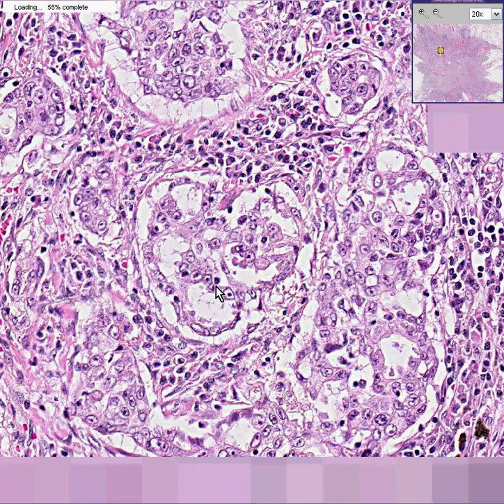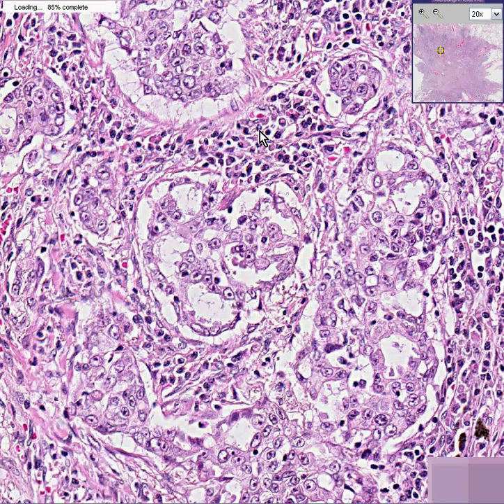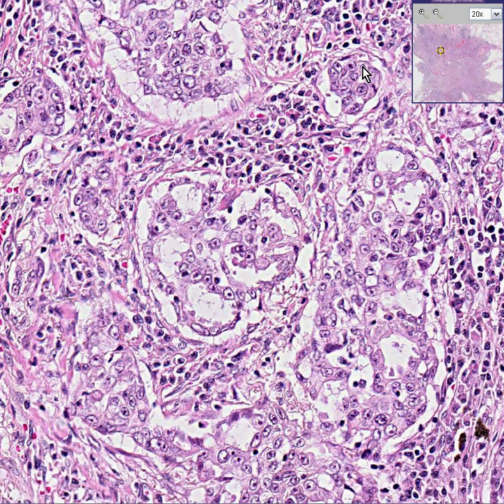In fact, I would like to think that the nucleoli of many of these tumor cells appears to be about the same size as the full nuclei of the lymphocytes. Here's a little tumor cluster here, same thing. Here's a little tumor cluster here, same thing. But once you see these little abortive tumor nests in which they are abortively trying to form a lumen, and some of them do, you know this is an adenocarcinoma.